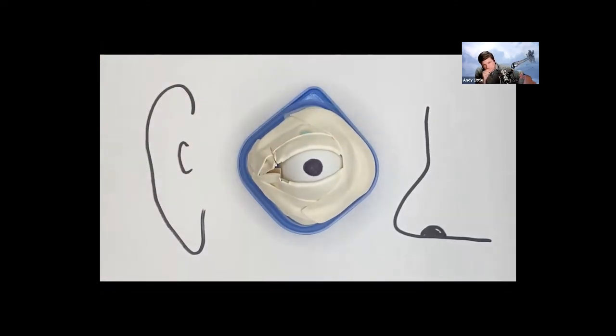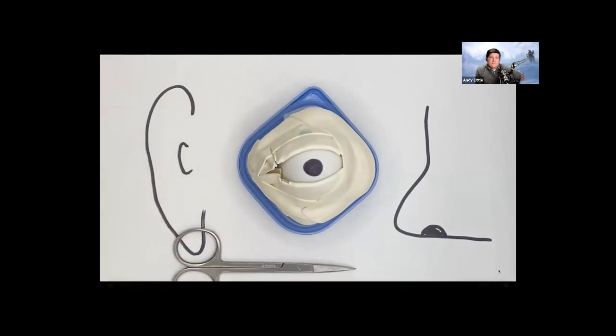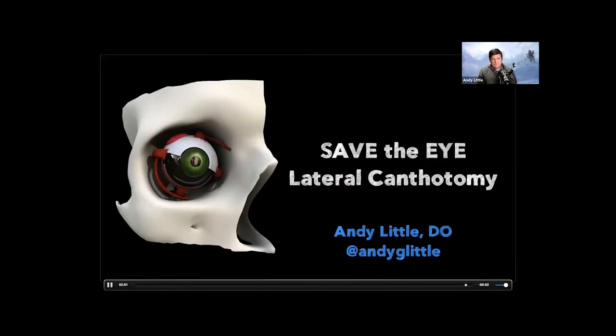Remember, this is a procedure that as you do it, ophthalmology should be en route, as the patient will need definitive eye surgery after this procedure. But again, I hope this quick video and using this model makes you feel more comfortable when performing your lateral canthotomy.